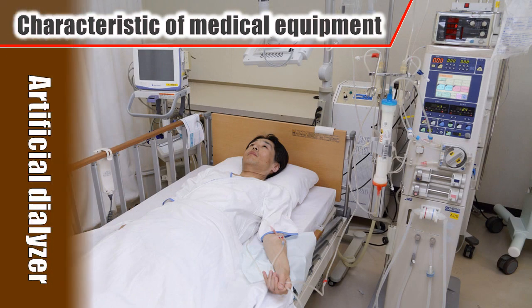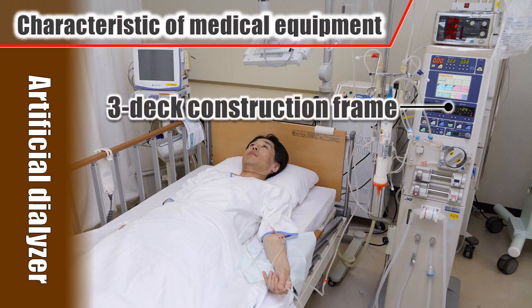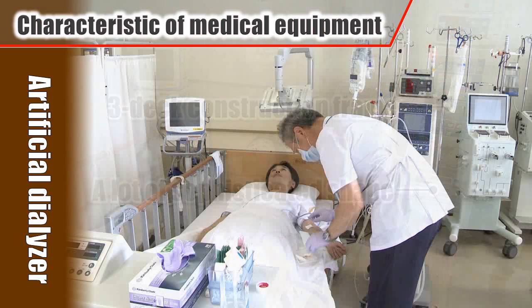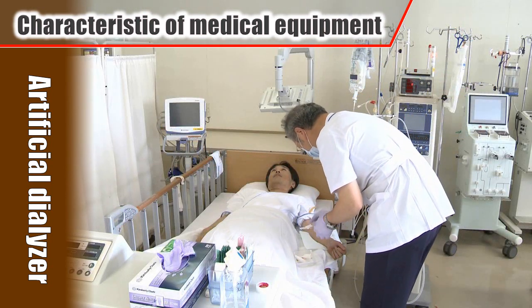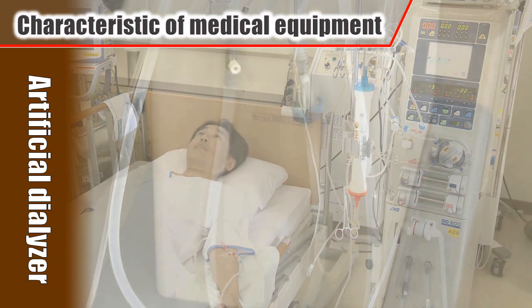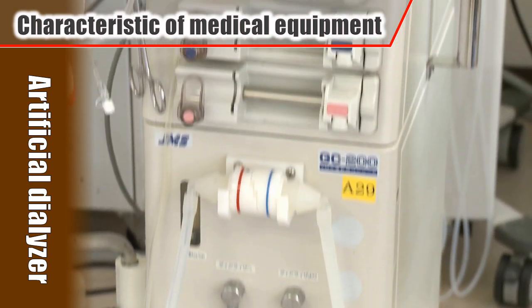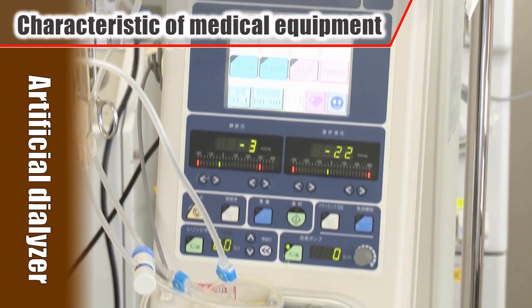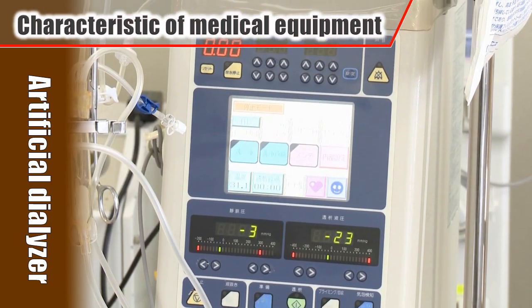Last is the artificial dialyzer. The inside is a 3-deck structure frame consisting of power source, piping, and a base. All parts are integrated and its characteristics are sophisticated shape with many bends. Assembly is done mostly with crimping and spot welding. Work efficiency is promoted by temporary assembly with the rivets, then spot welding. Material used are mostly stainless steel. Plastic is used for the exterior cover.